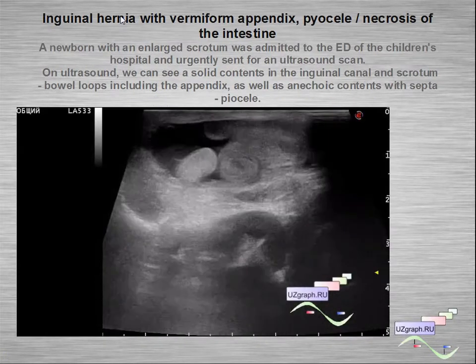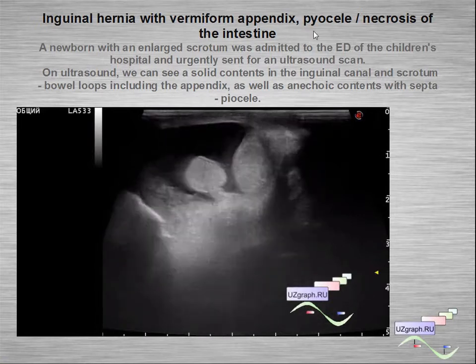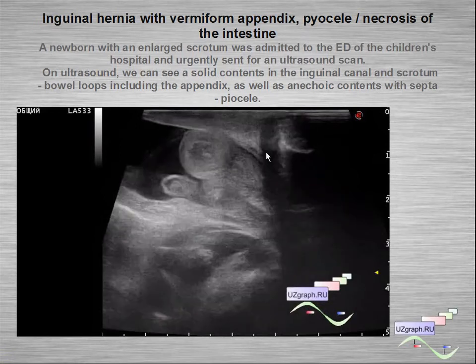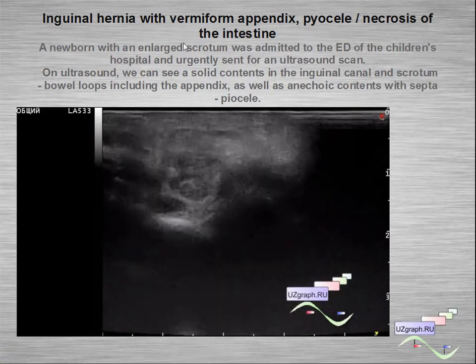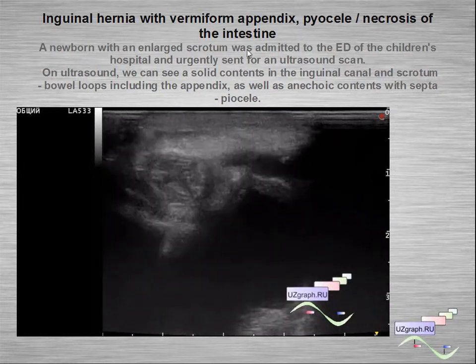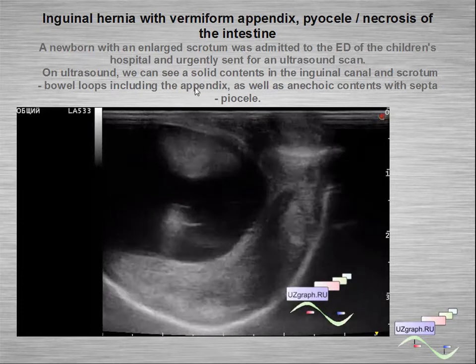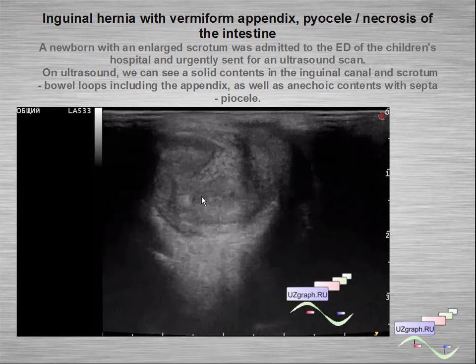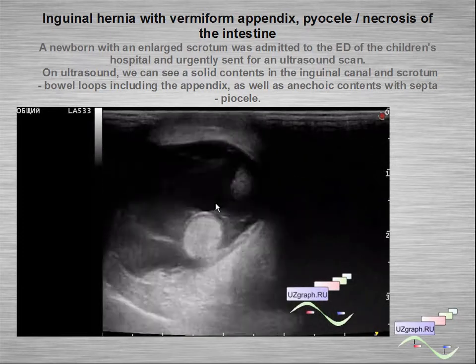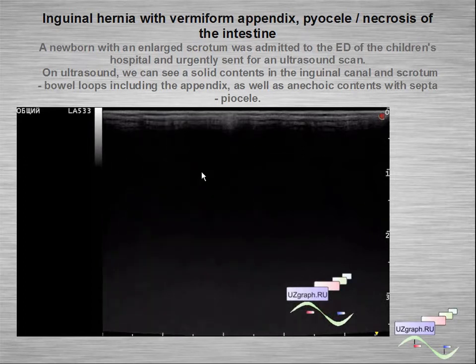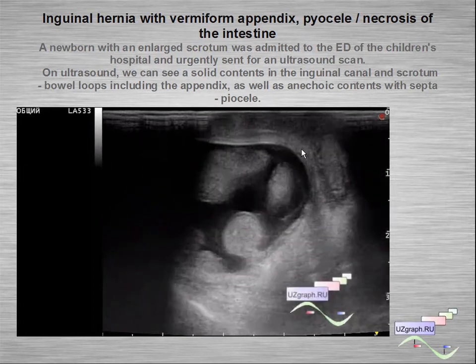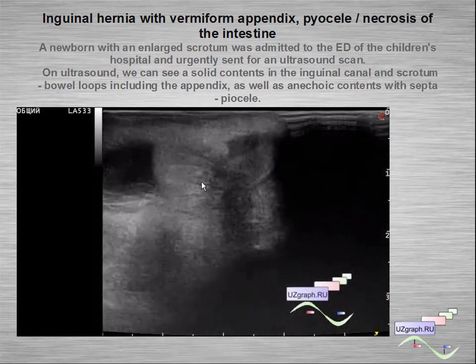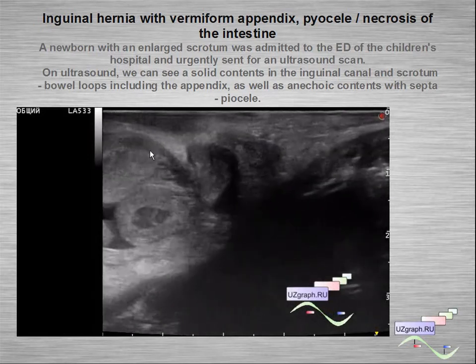Inguinal hernia with a vermiform appendix: in another case we can see the appendix in the scrotum along with other intestinal loops. This is a newborn child with an enlarged scrotum sent for ultrasound; we can see solid content, anechoic content with septum, and intestine with thickened wall. This is pyocele and inguinal-scrotal hernia.